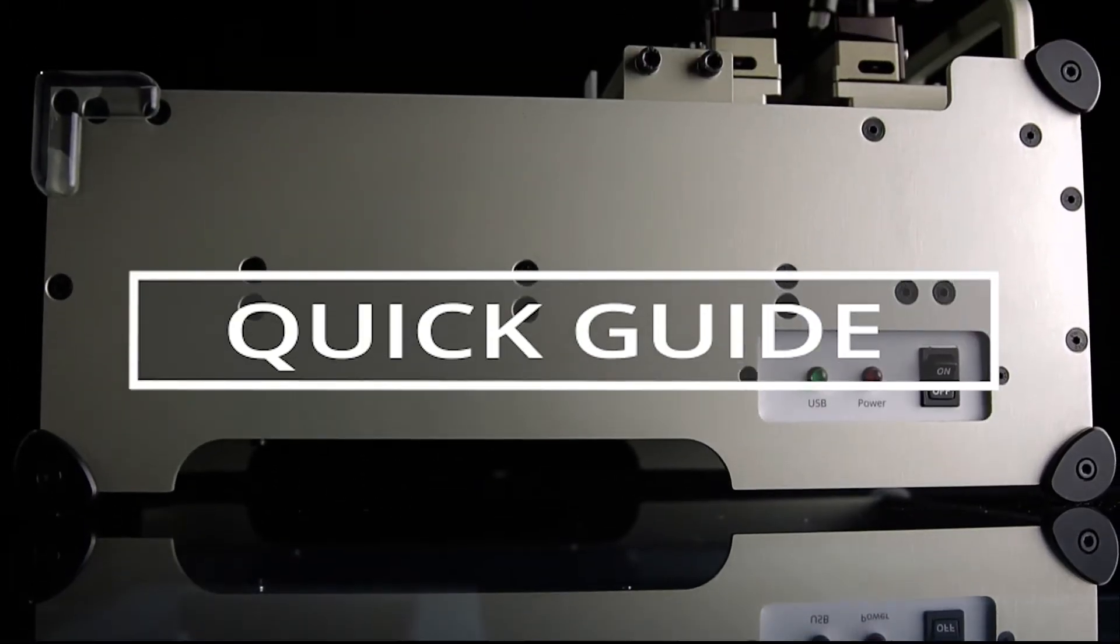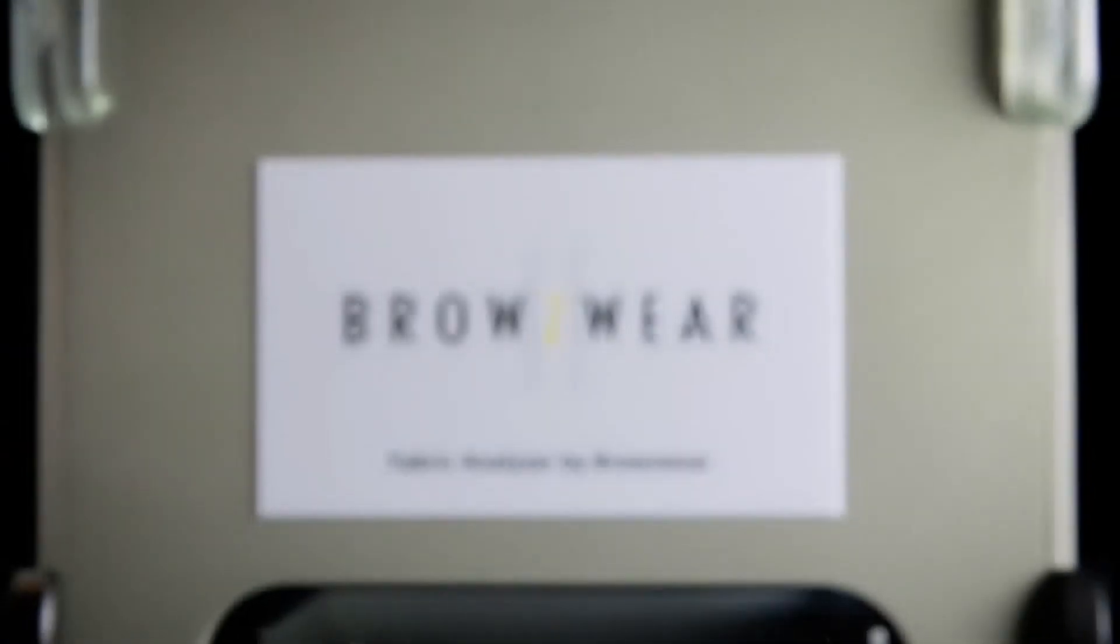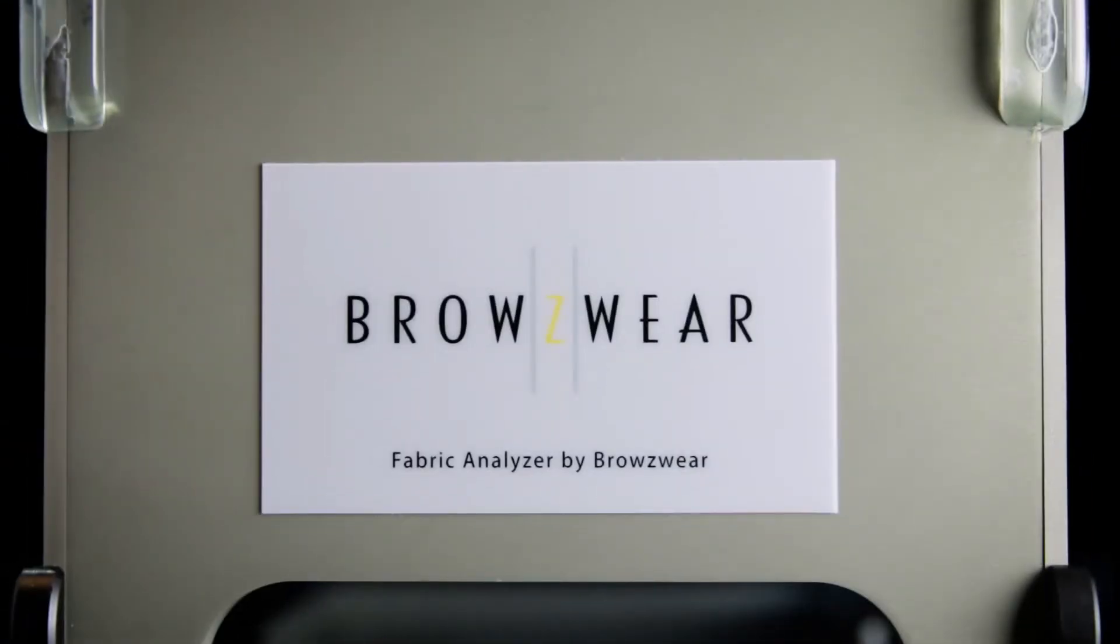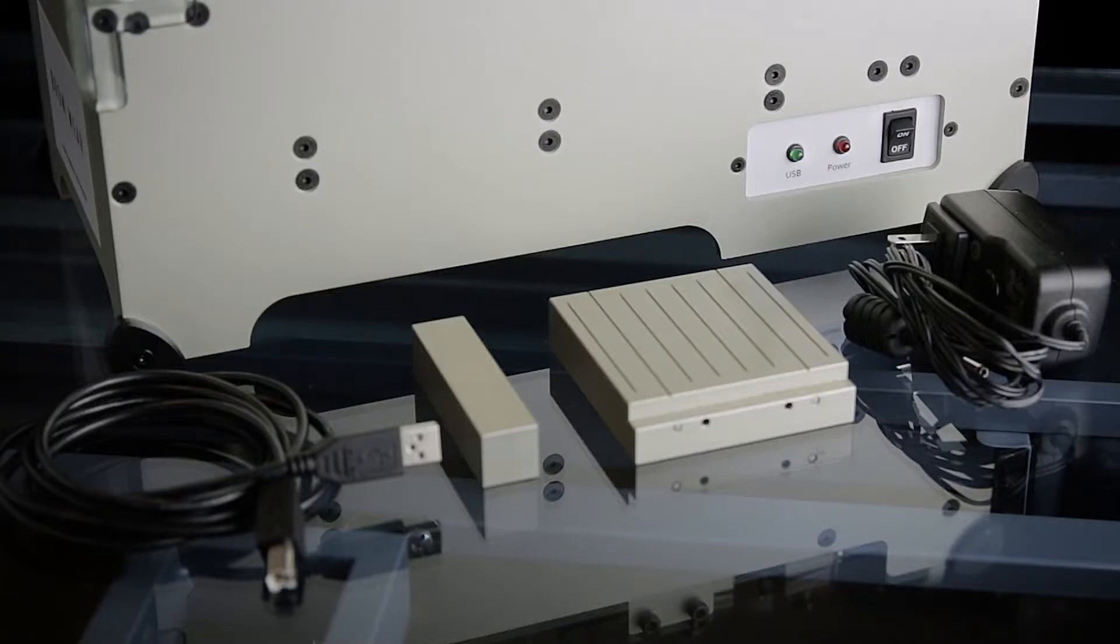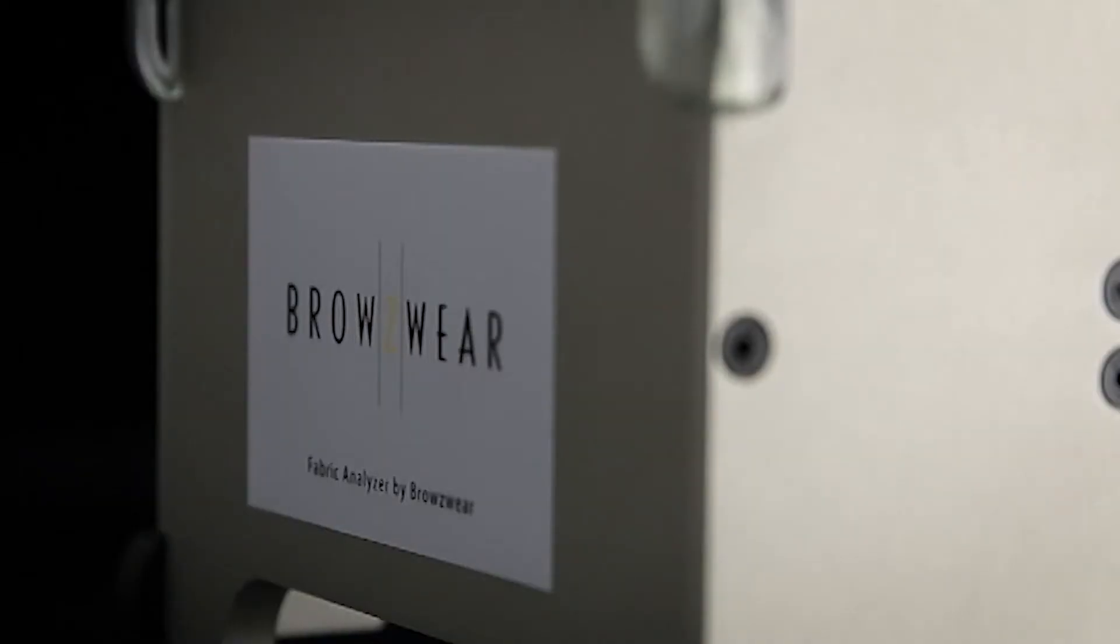Welcome to part 1 of our 2 part quick guide video series for the Fabric Analyzer by Browseware. Here we will cover the process of setting up and using your Fabric Analyzer by Browseware, or FAB.